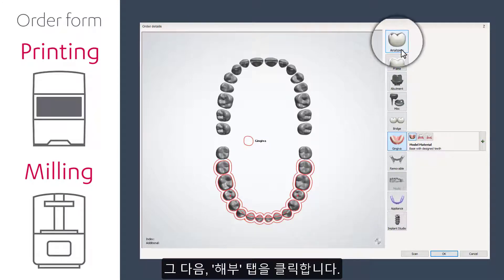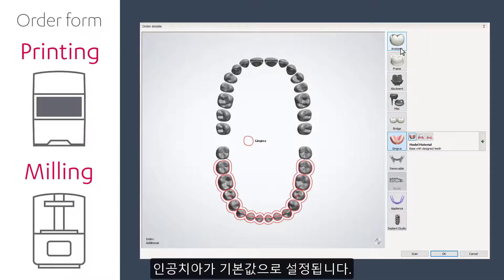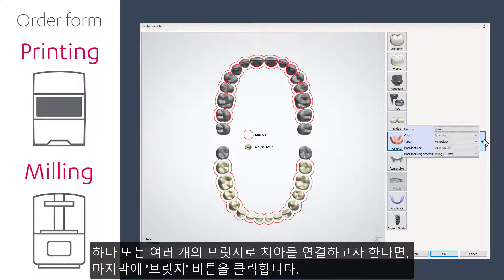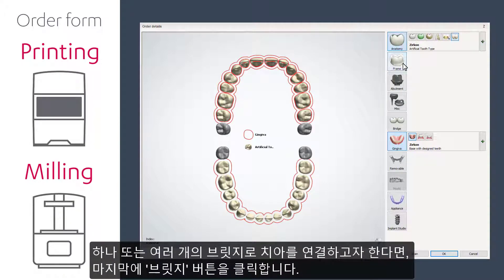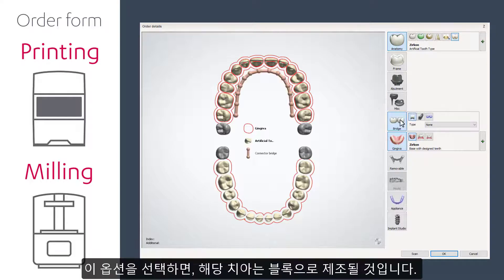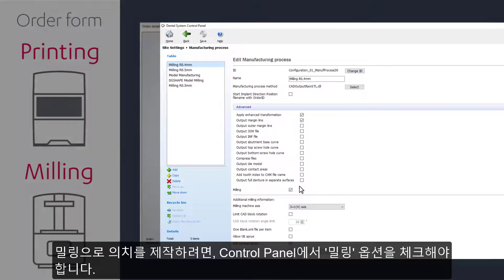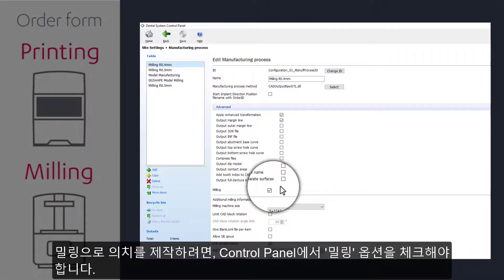After that, select the Anatomy tab. The artificial teeth will be selected by default. If you plan to join the teeth into one or multiple bridges, then the last step is to select the Bridge tab. The teeth will be manufactured as blocks. Choose the relevant material and manufacturing process for each element, either for printing or milling or both. Keep in mind to have the milling checkbox in the control panel enabled when you plan to mill the denture.